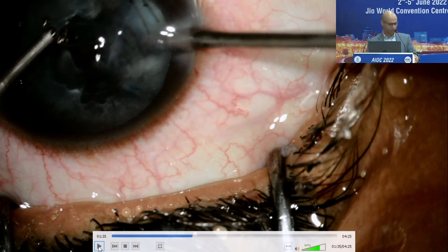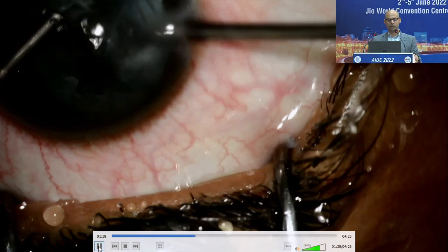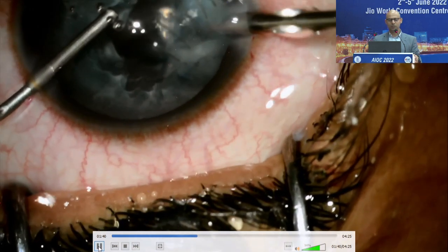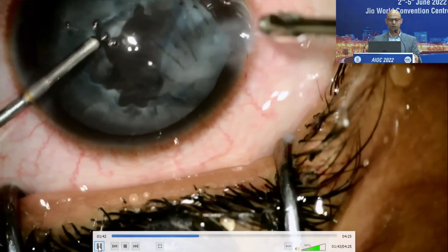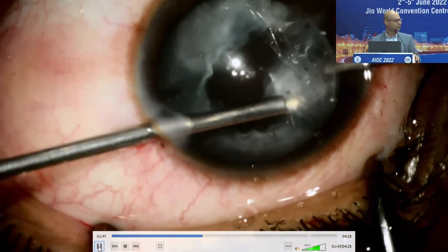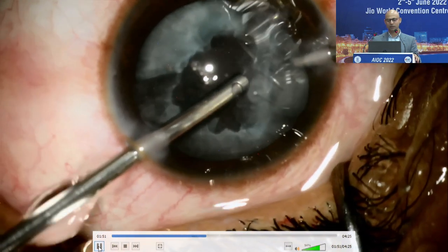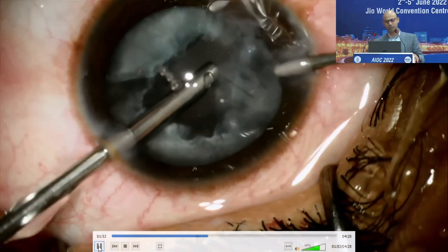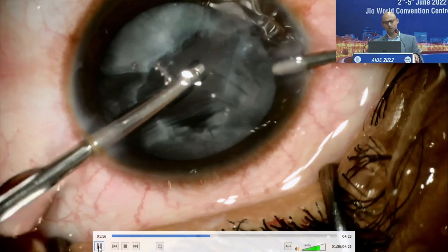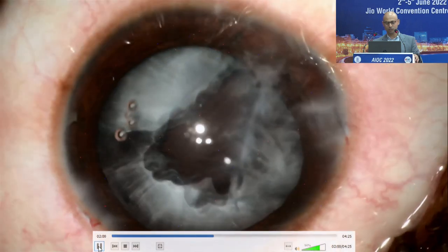Should I proceed? Yeah, please. So, as you can see, we are now doing the anterior vitrectomy. It's always good to first go behind the posterior capsule, remove the central part of the anterior vitreous first, and then whatever is anterior to that, you can clear, because then they will not have a posterior attachment, using it in a higher cutting and lower aspiration rate mode.